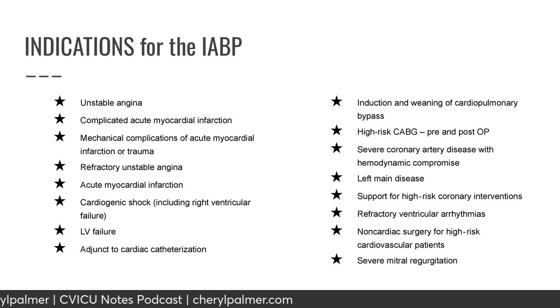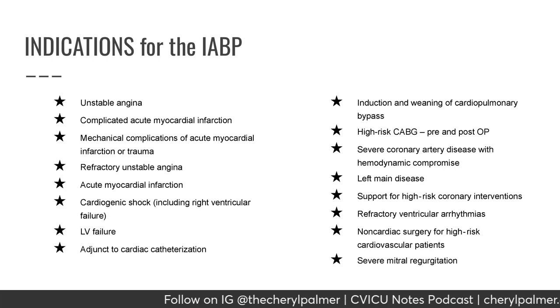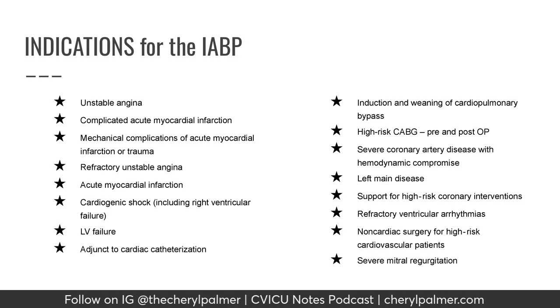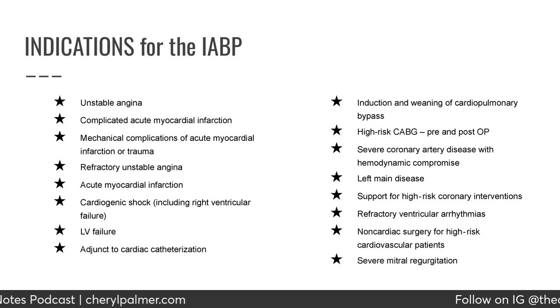Severe coronary artery disease with hemodynamic compromise, left main disease, support for high-risk coronary interventions, refractory ventricular arrhythmias, non-cardiac surgery for high-risk cardiovascular patients, and severe mitral regurgitation.